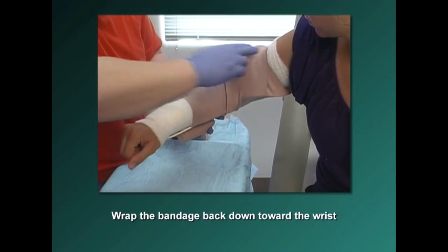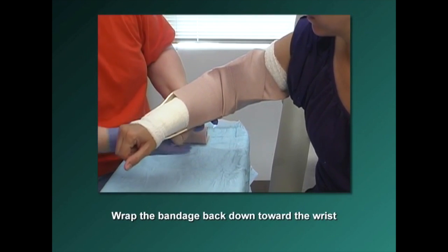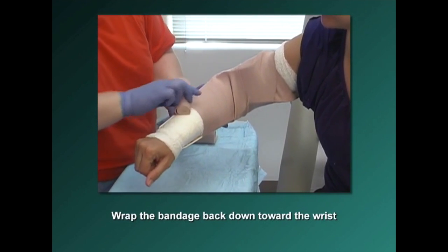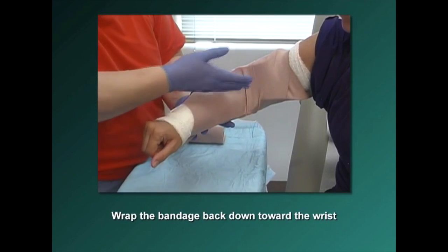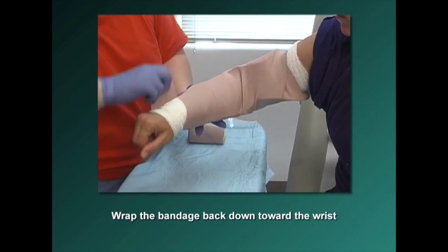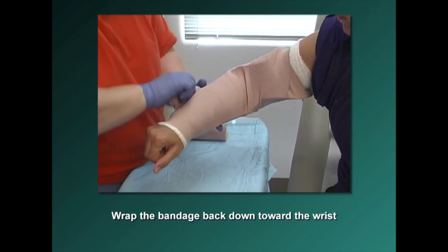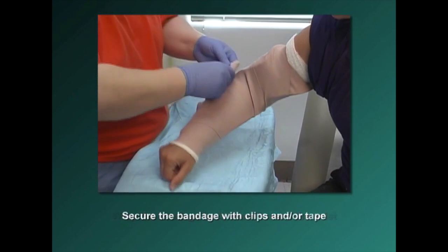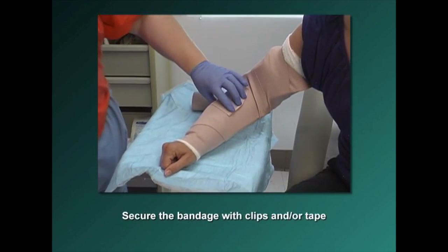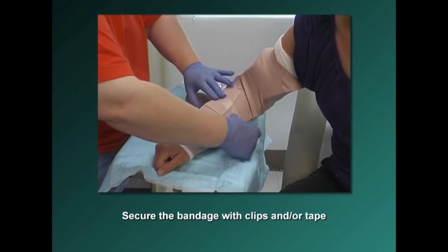The padding should go above the splint on one side and below the splint on the other side, so there is no plastic against raw skin. Even though the wound is present, the padding has to go the full length of the splint. Secure the elastic bandage with clips and or tape.